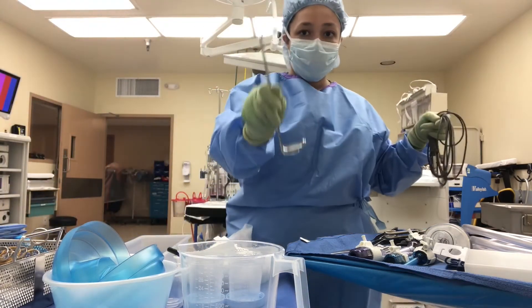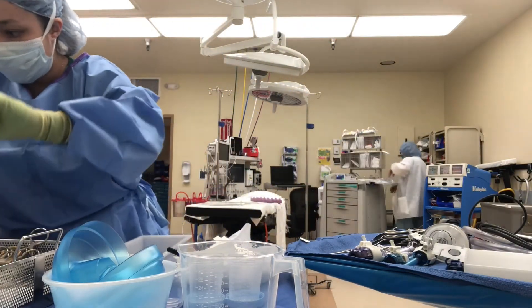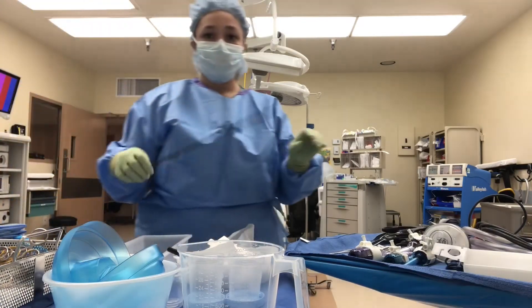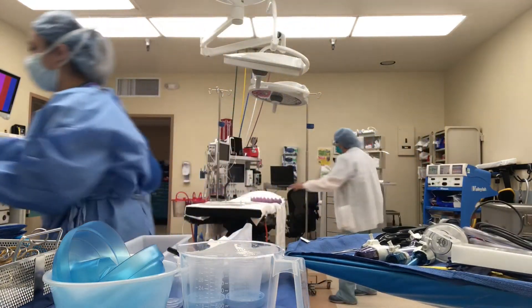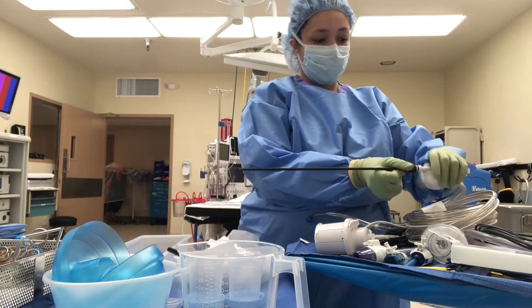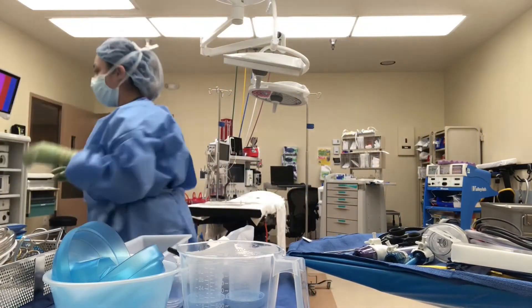Now I'm going to bring up some more instruments. Here are the army-navies, used to retract, and a monopolar cord. Here is another dissector, which is a right-angle dissector — not a lot of doctors at our hospital use this, but it is a dissector. Here is a suction tip, which is what gets screwed on to the suction irrigator, as I will show you in a bit. This is a suction irrigator; it has two buttons — the blue one is for irrigation and the red one is for suction. The other end goes off to your nurse in the field and connects to both the suction and a saline bag.